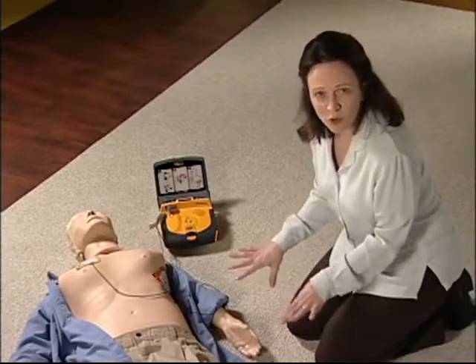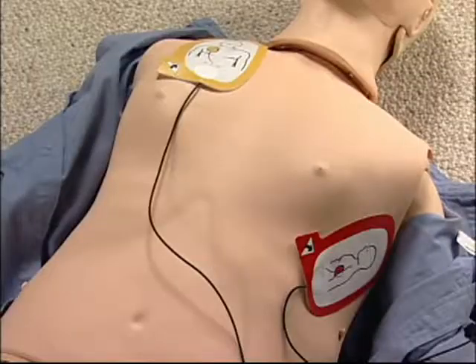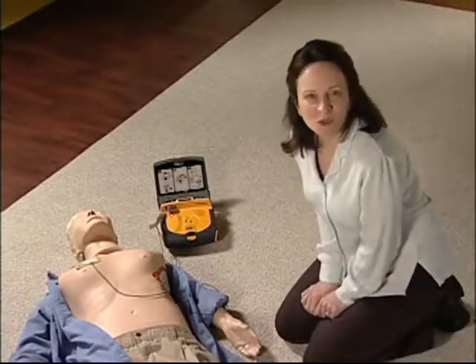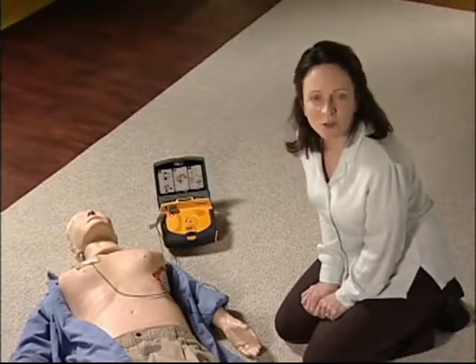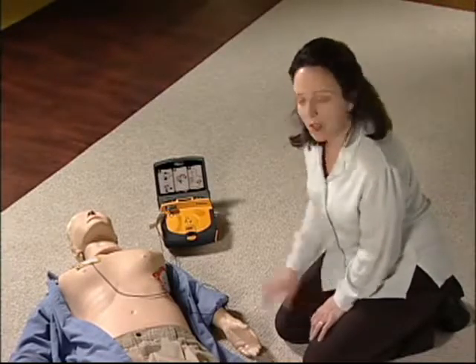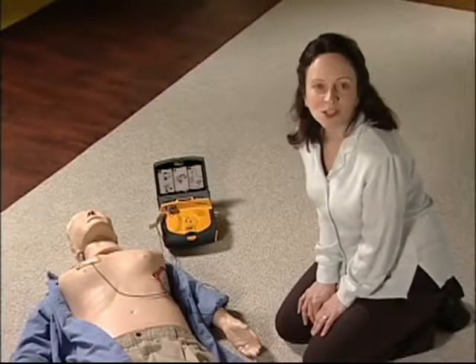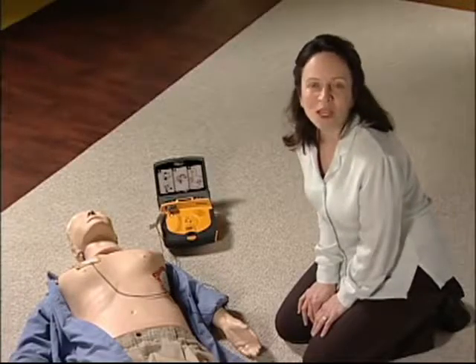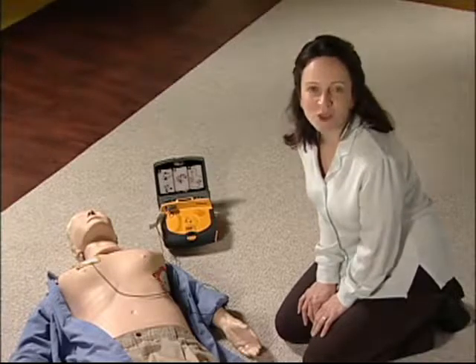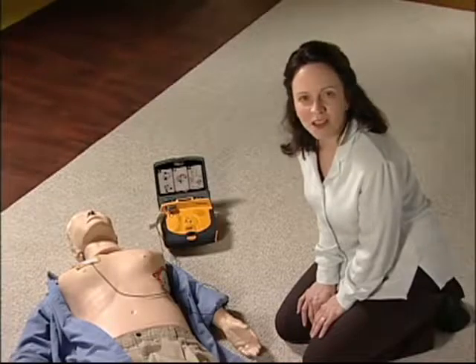Even if they start to move or breathe normally, don't take the pads off. The Lifepak AED will keep monitoring the patient and will tell you if another shock is needed. And that's it. Just do what the Lifepak AED tells you from the moment you turn it on. You can also refer to the quick reference guide inside the lid if needed during an emergency. When the emergency medical team arrives, you may have saved critical time by starting treatment before they get there. Even better, you might have just saved a life.